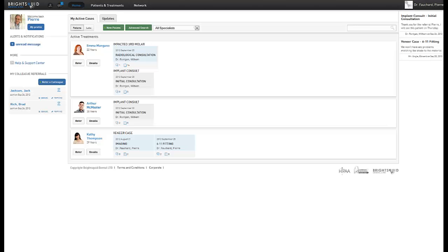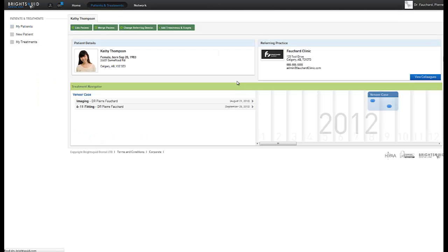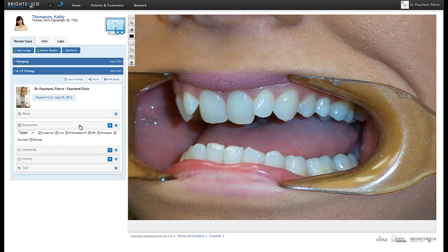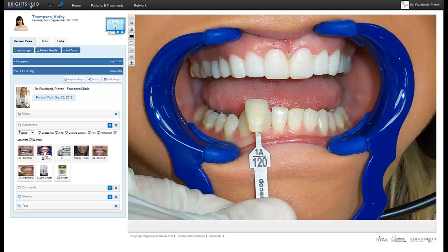When viewing any stage in a treatment plan, any image-based files will be displayed within the image viewer on the right side of the screen. Normal photographic or extra images in common file formats such as JPEG, GIF, or PNG, among others, will be displayed in the image viewer we see here.